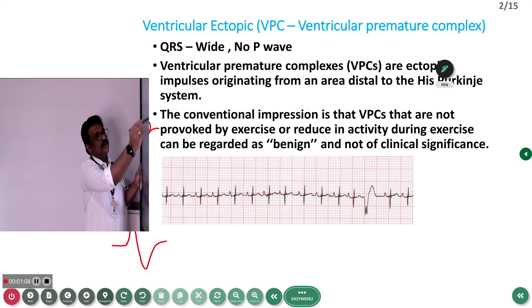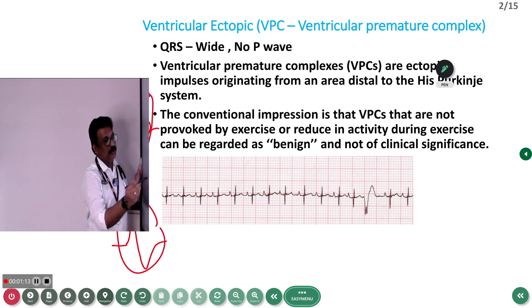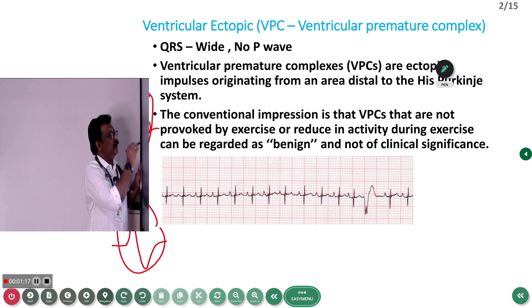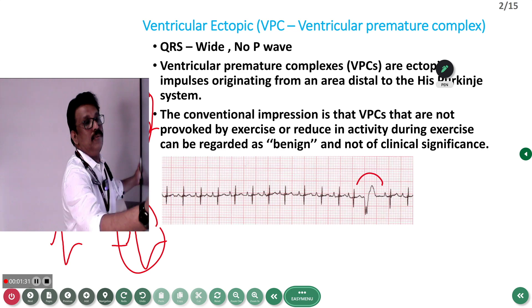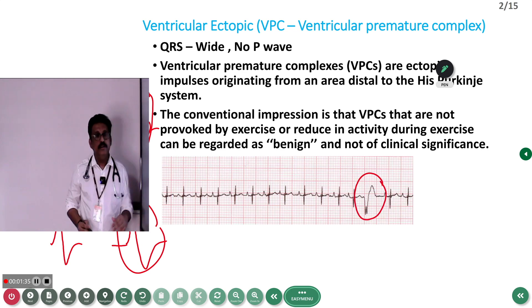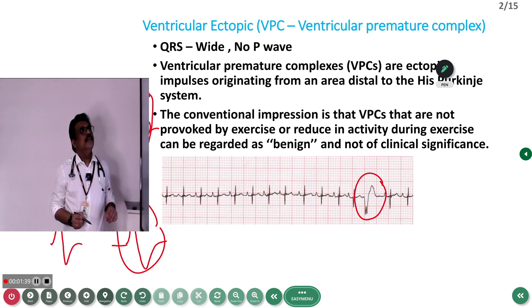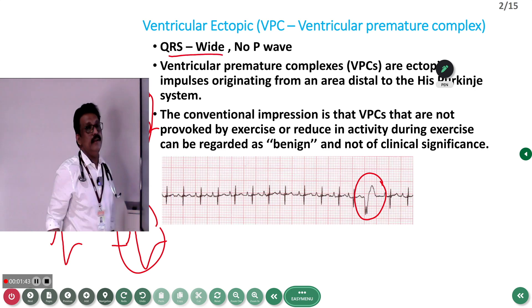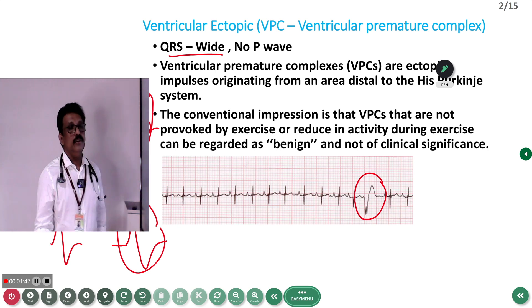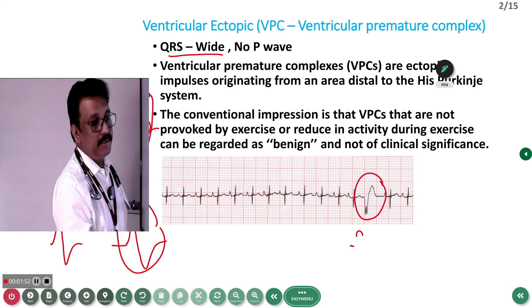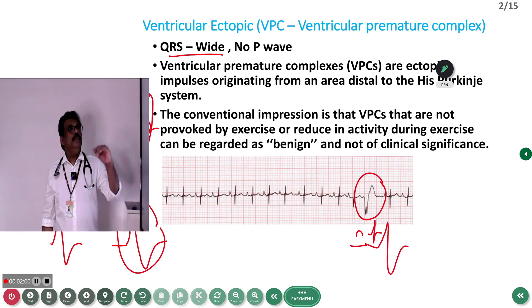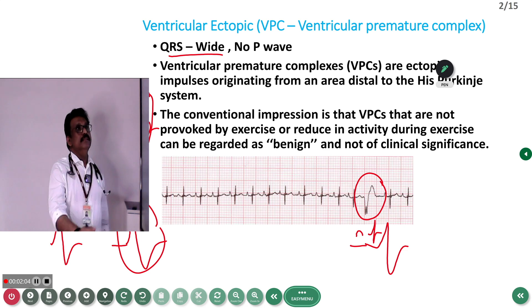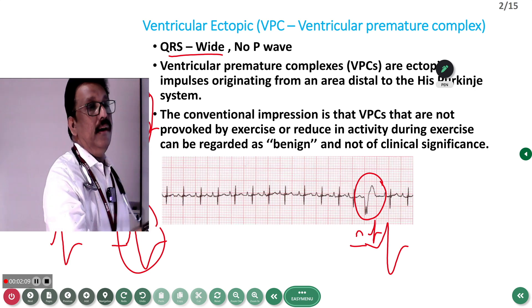This ventricular activation is slightly different from a normal ventricular activation — it is slightly delayed. When conduction occurs through the normal pathway you get a narrow QRS complex. But when it comes from an ectopic focus, it has to travel to the regular pathway, so it becomes slightly wider. In ventricular ectopic, the QRS complex is always wide and there is no P-wave, whereas normally a P-wave has to be present and the QRS has to be narrow.